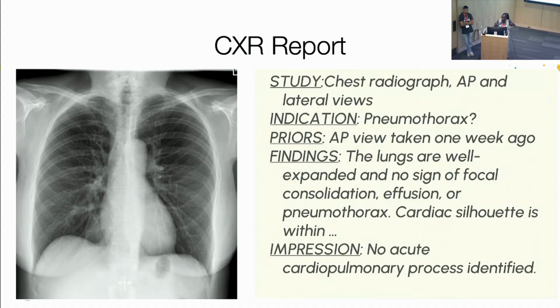That's where you want AI to shine, right? Because it's helping the radiologist, right? But those types of labels are not very easy, I think, to curate. Does that make sense? So you want the misses, the things that I've missed, but if you just relied on my reports, you would never know what I missed.